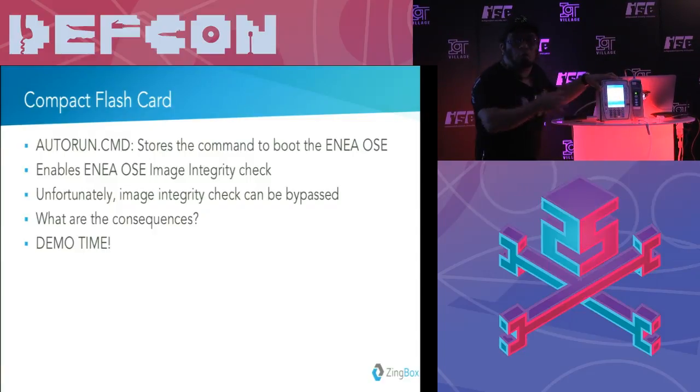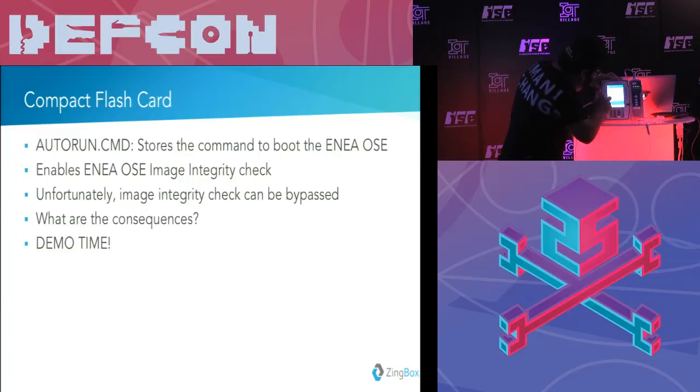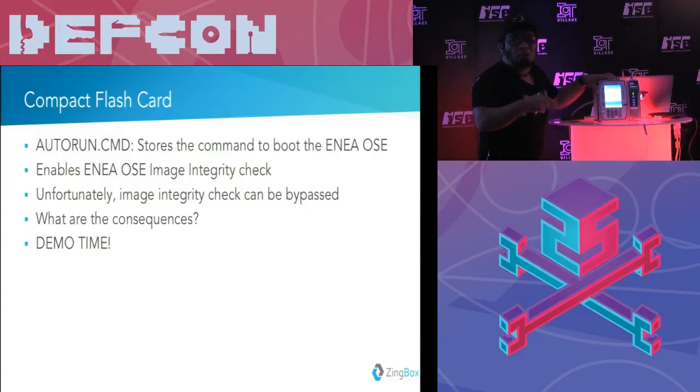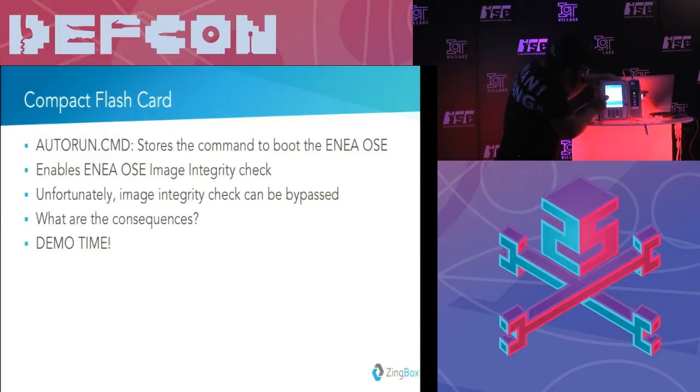So if you remember the infusion pump, right, when it is the setup, when you put the rate and you put the volume to be infused. So let's do it again. So here, if you notice something different, I just put it purposely. I just changed the form to Primera in Spanish, just to show you that you can change this front end. But not only that, because I can change the screens, I switch between the rate and the VTBI. So basically, the rate is at the bottom and the VTBI is at the top. You see that?